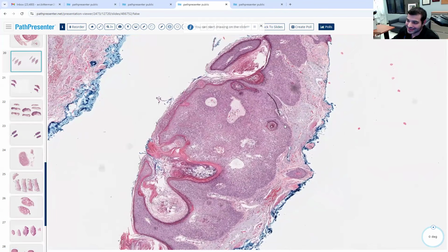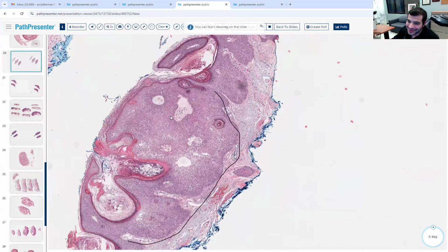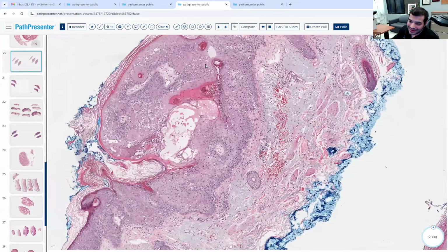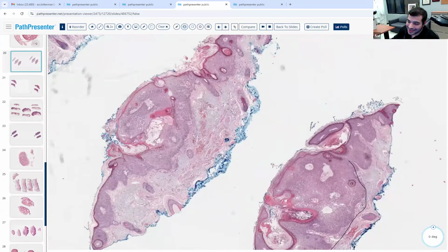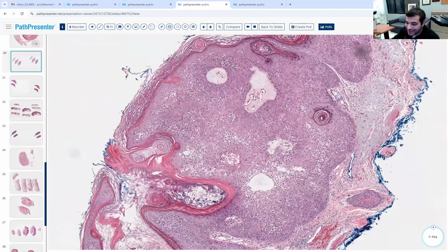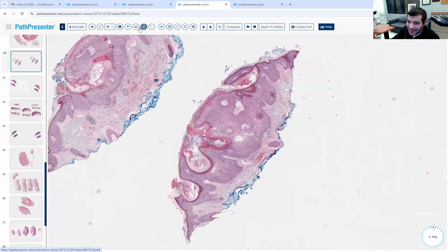See how normally we have sebs protruding outward. This is more protruding inward, if anything. More so here. But it has an architecture otherwise. It has the squamous eddies. It has even pseudohorn cysts. And this has a completely benign silhouette.